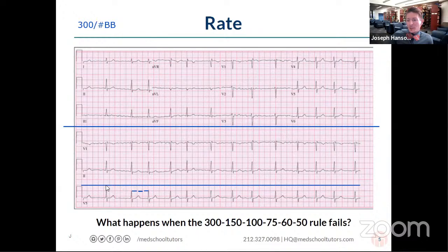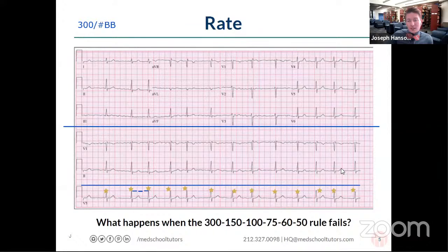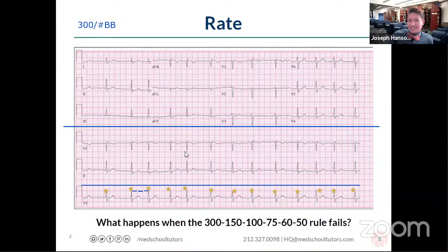So the other thing we can do is count — one, two, three, four, five, six, seven, eight, nine, ten, eleven, twelve, thirteen — and multiply it by six. That gives a heart rate of 78, which was not the same as what we got with the big box rule.